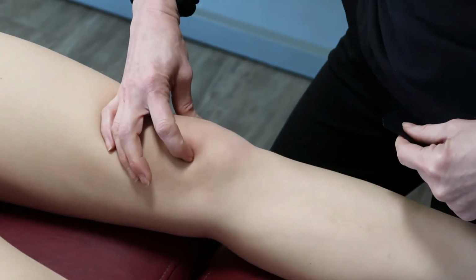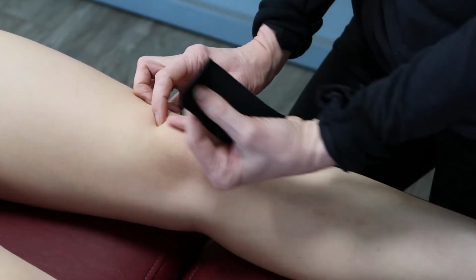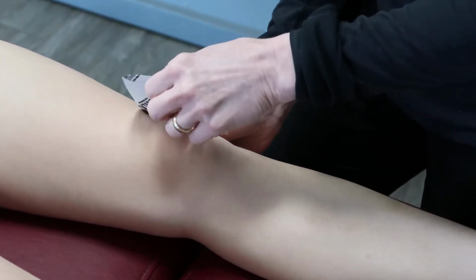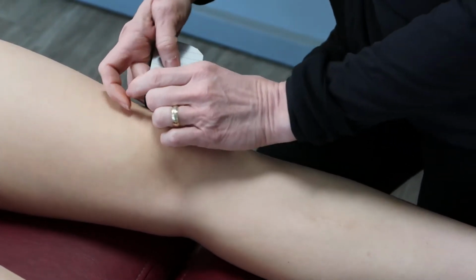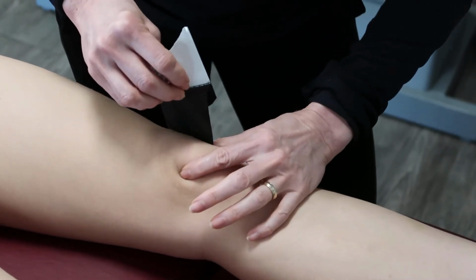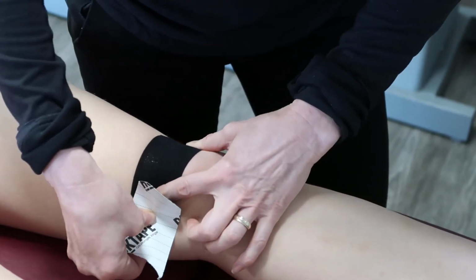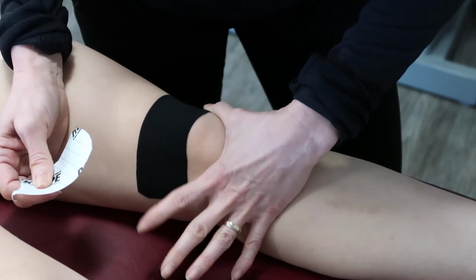So again, for this particular patient, I like to take the first strip and bisect the patella into superior and inferior aspects. Take the top half of the patella, put my base down, and hold that steady as I then tilt the patella. I'm going to hold the base and just tilt the patella medially, and you'll want to kind of pull down on this side here. And after you get that dynamic completed, your last part of your strip is just laid down.